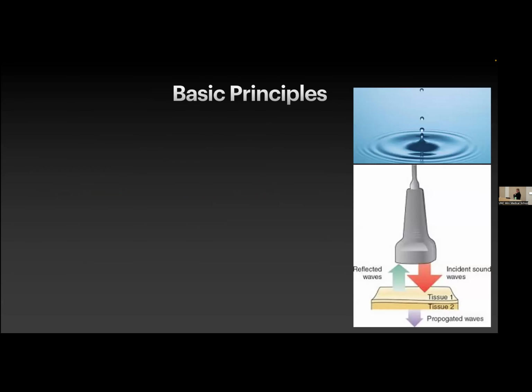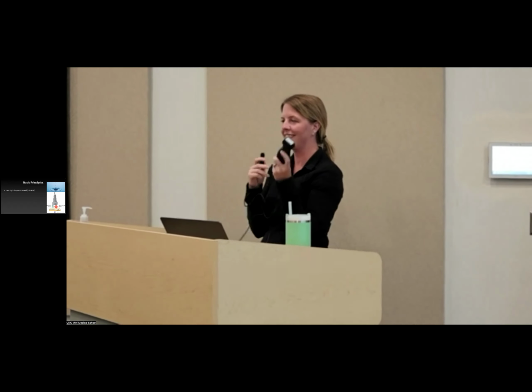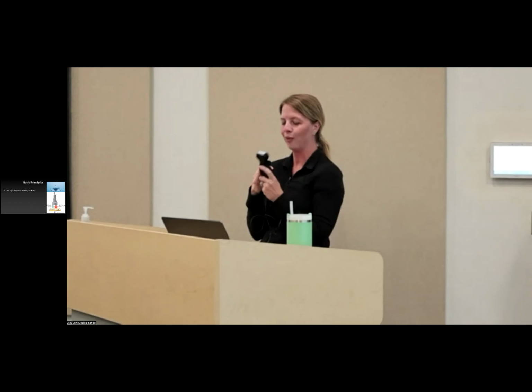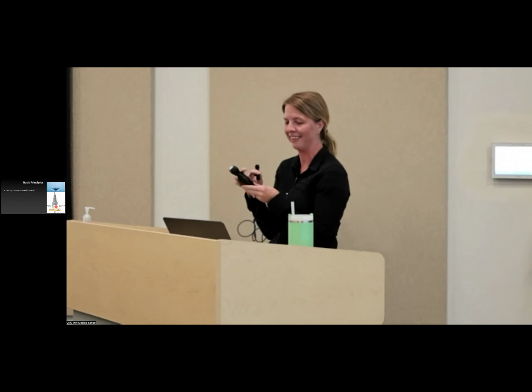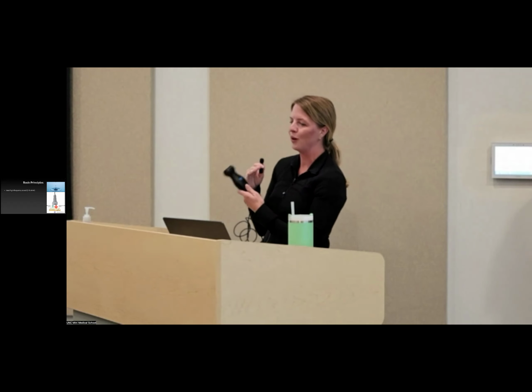So we talked a little bit already about the basic principles of ultrasound. I have the probe over there, but basically, I'm gonna bring this with me for a second. I mentioned that there's an emitter, a transducer, and this thing is very expensive actually, because there are very special crystals in here. I always tell my residents, don't drop it. This is very costly. Maybe not as costly as a magnet for an MRI.